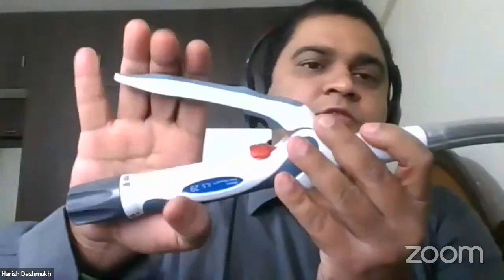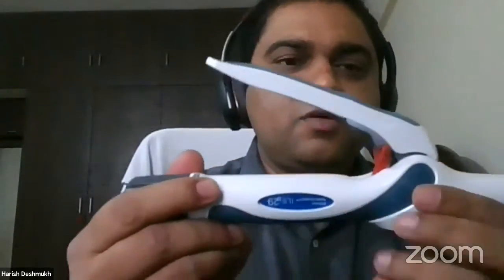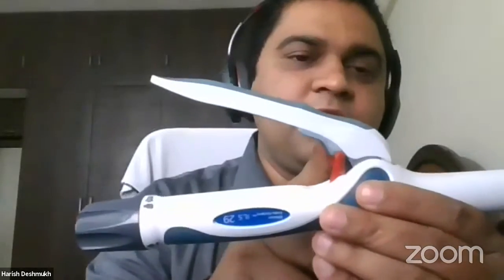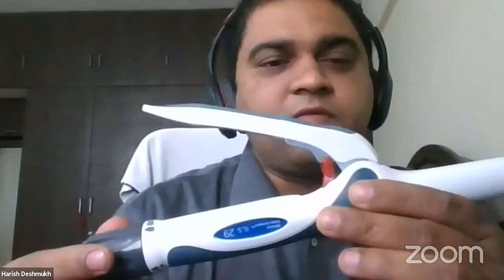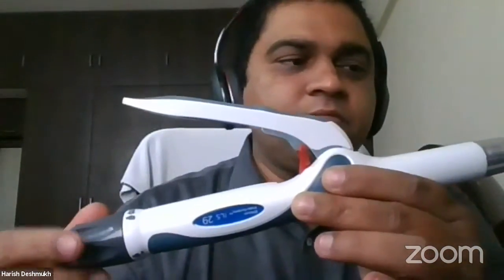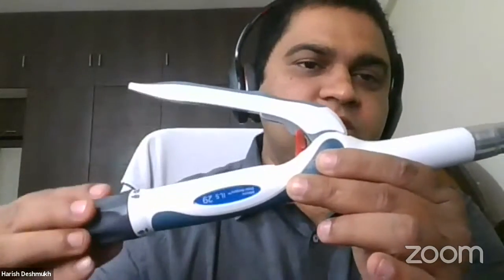You have to remove the safety lock. For firing, you have to fire it with complete force in one go. Plastic to plastic. Plastic to plastic means this is what it should be. Once it is plastic to plastic, open it up and push the safety lock back to its position, because it has only one-time firing. In case you accidentally fire it again, you may have a leak in the anastomosis. So only a single time. Then open it up slowly with 2 twists. 2 complete rounds are required here.